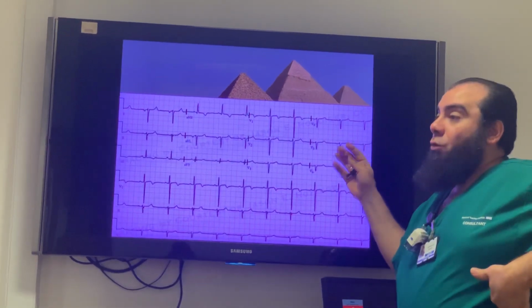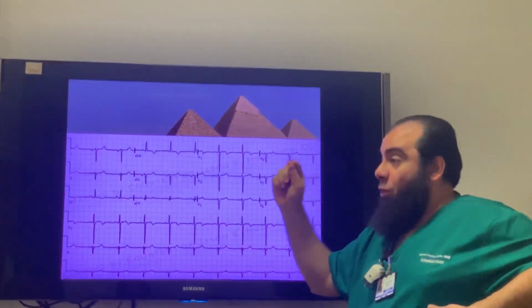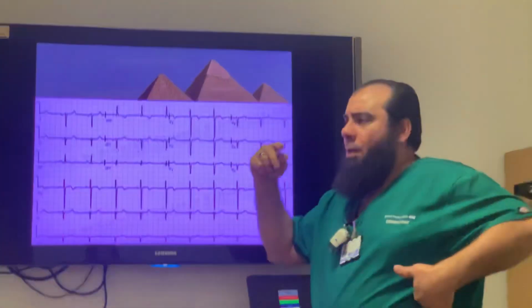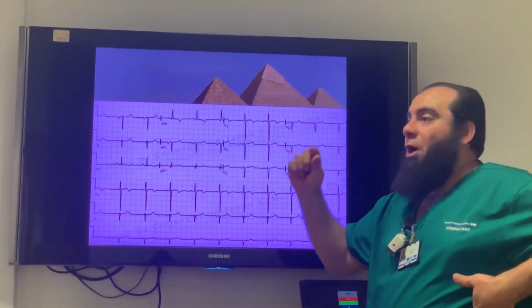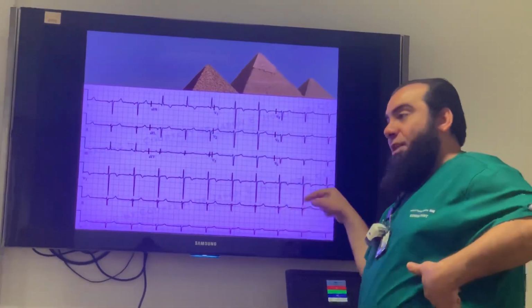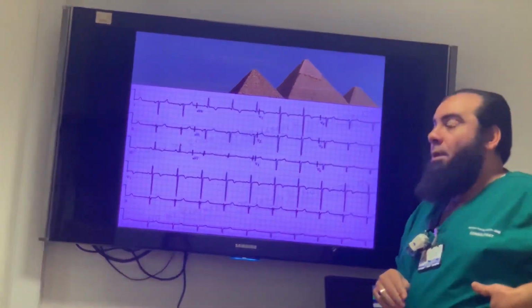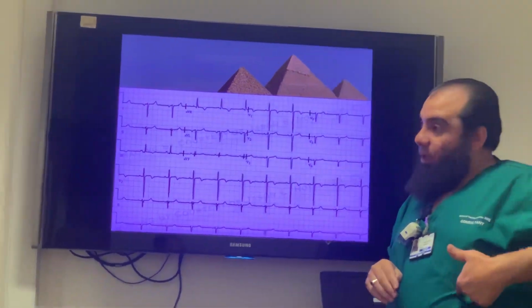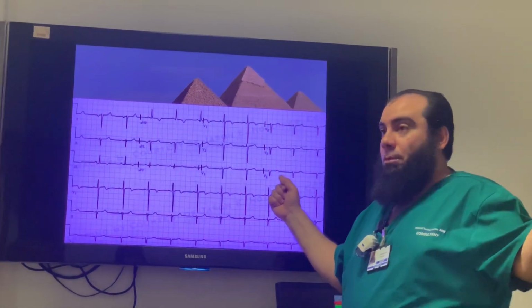chest leads? Usually we have a progression in chest leads. The R wave progresses, starting initially small. We're going to discuss that in the next lecture, but just a quick differentiation. The R wave is supposed to be small, getting larger as we move to V6, until V6 will be an absolutely positive complex. So if it goes this way, we are most likely speaking about reversed limb leads.